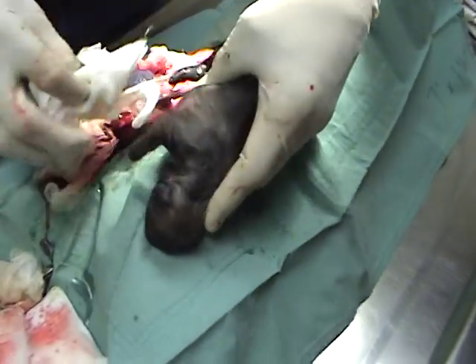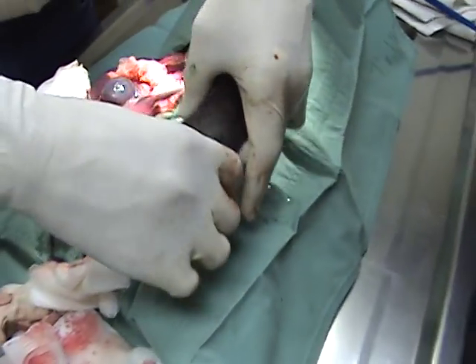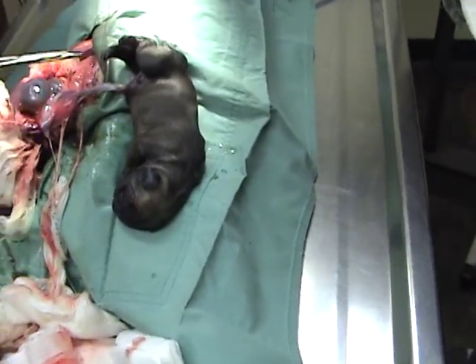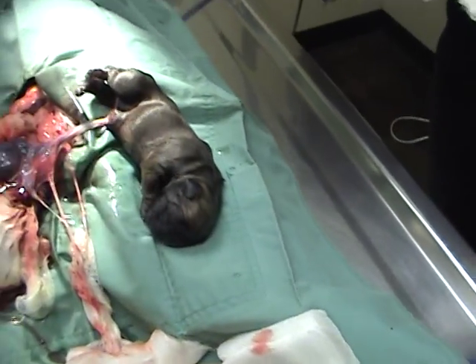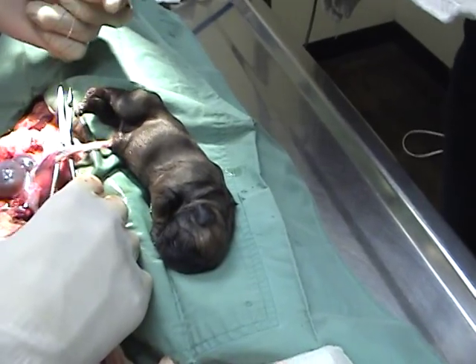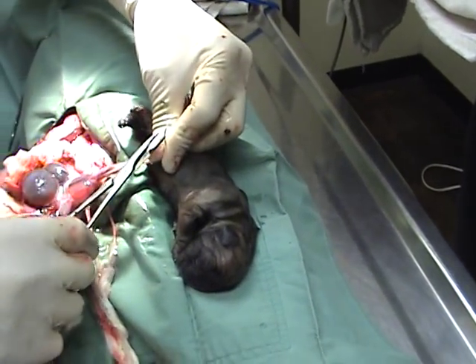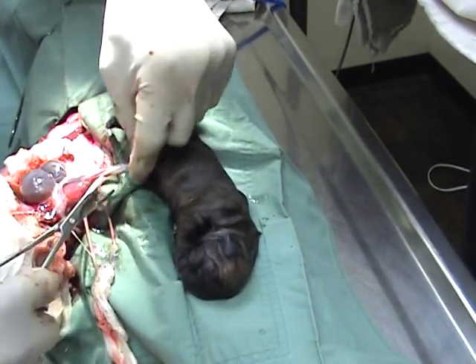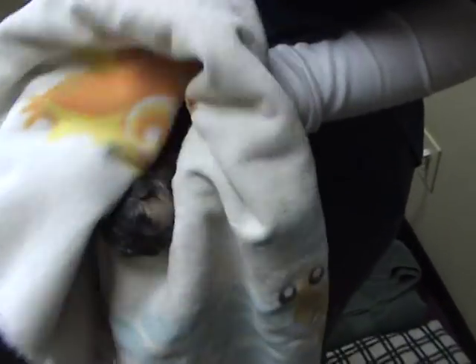Typically puppies we produce range from about 7 ounces being small and 12 being big, and this one is up at that 11 to 12-ounce size, which is good. And that one is actually breathing, so that's a nice sign. Typically you might see they're completely lifeless and they'll scare the heck out of you and nothing may happen for two or three minutes. But this puppy is actually taking breaths and he's going to be moving in just a little bit. Dr. Keith is tying off the umbilical cord so we can cut it. Then this puppy goes to Kristen and she starts to get pretty rough with it — she needs to get the fluid out, dried off. You're already squealing — that's a really good sign. That doesn't normally happen for a minute or two, so you'd like to hear that.